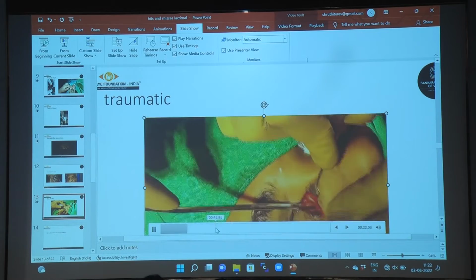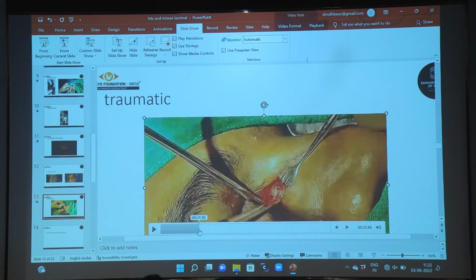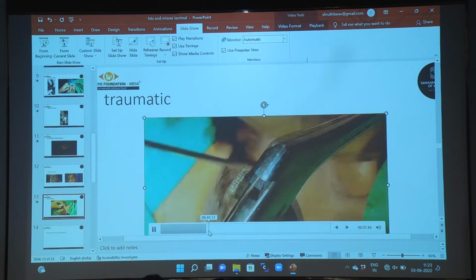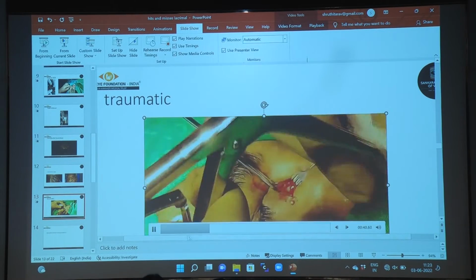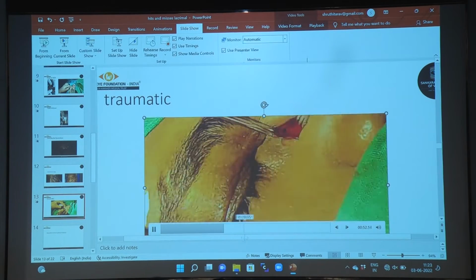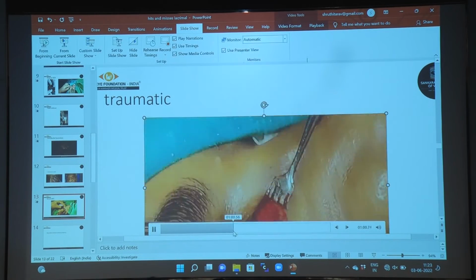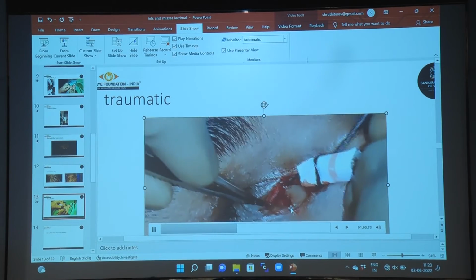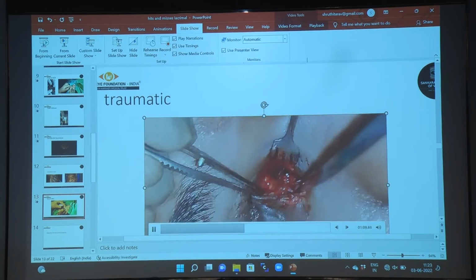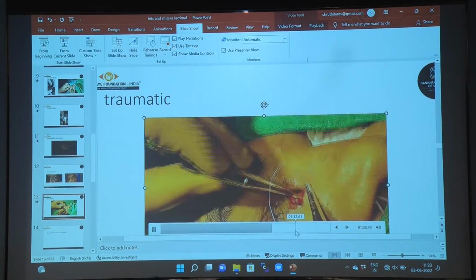So even here, it can be slightly bloody with fibrotic tissues. The only difference that I find when I'm doing a DCR in these patients is the bone can be relatively thicker, because of the trauma that they've had, the fracture that they've had there, and the remodeling of the bone that has happened. So otherwise, it's relatively straightforward. So you can make a nice big large sac flap, and the nasal mucosal flap is done, bicanalicular intubation placed, and the wound closed.